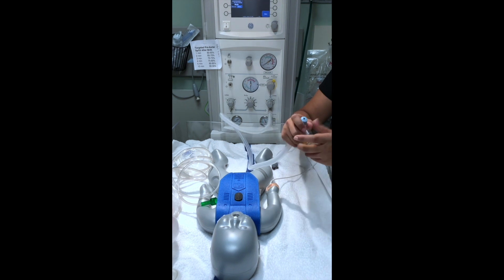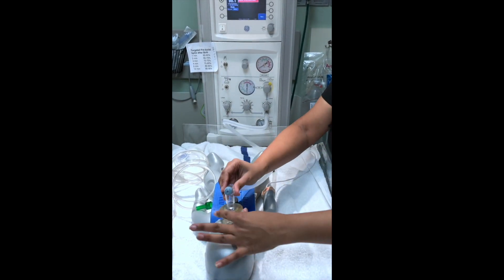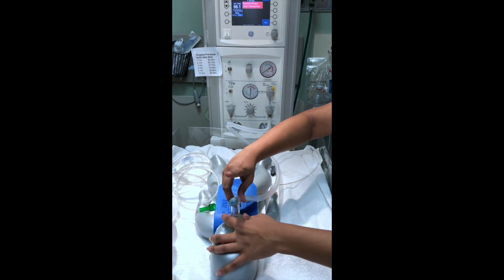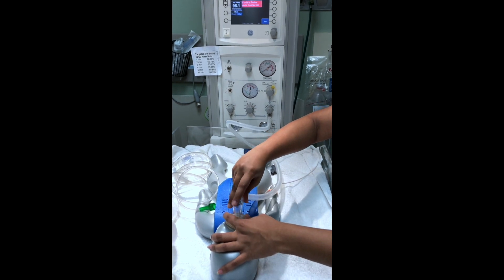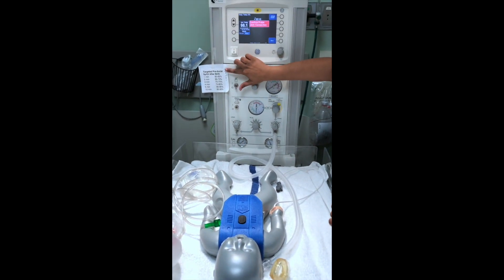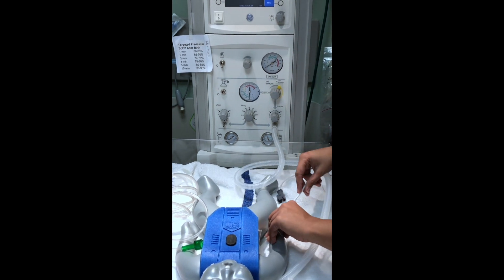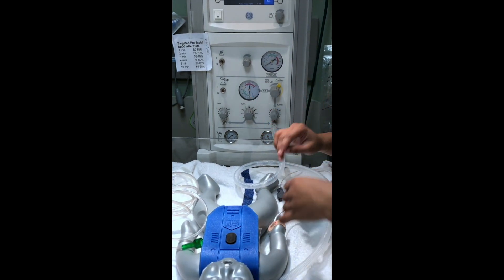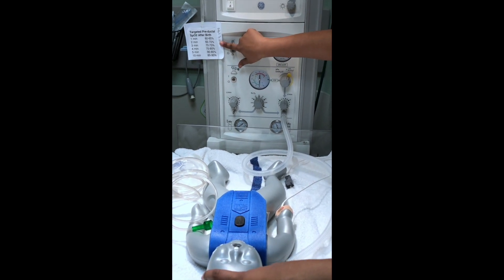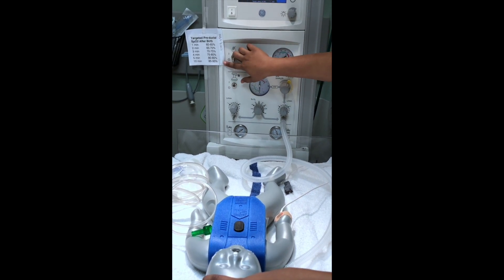If you want to do blow-by oxygen with the NeoT, you can just hold it there to the baby. Just holding this and not occluding anything will be CPAP for the baby. And if you want to BVM the baby, you can just tap on this. Your rate is 40 to 60 for newborns. Over here we have something that has to do with the pre-ductal SPO2 after birth. Your SPO2 should be on the baby's right hand on the palm. If your baby is 3 minutes old, a normal SPO2 would be 75%. Your baby will only reach 95% SPO2 after 10 minutes of birth.